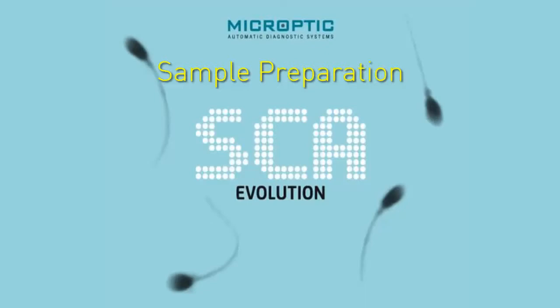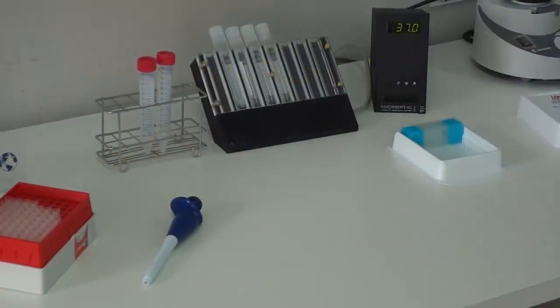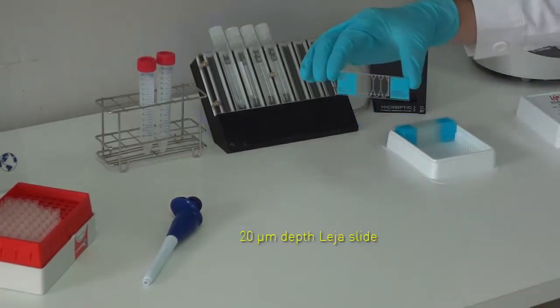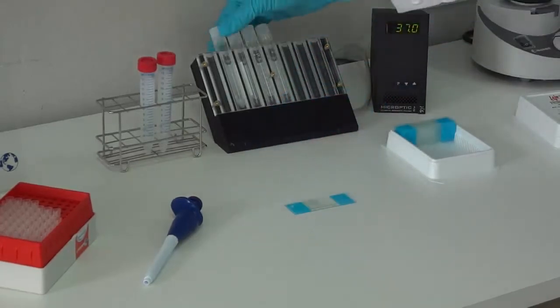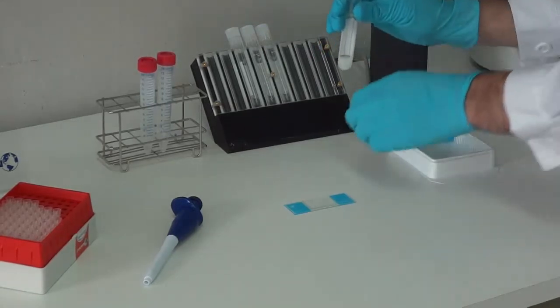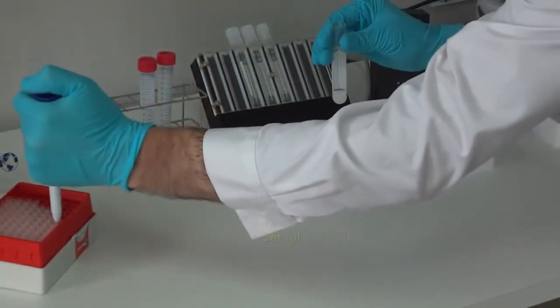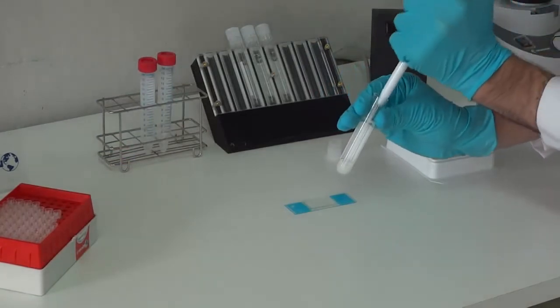Motility and concentration sample preparation. First step is to prepare a sample for motility and concentration analysis. Other disposable slides can be used. Take the sample at 37 degrees centigrade, mix gently and pick 5 microliters using a positive displacement pipette.